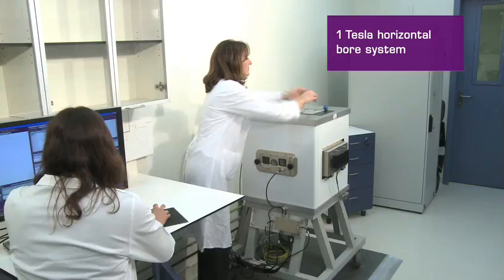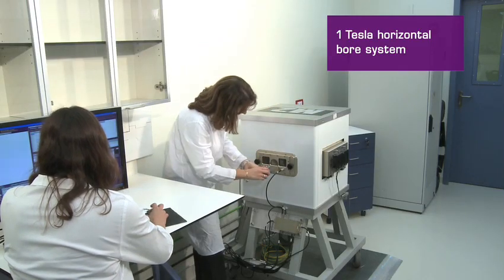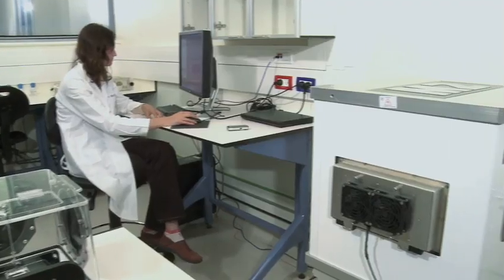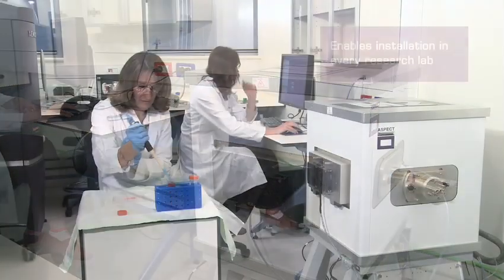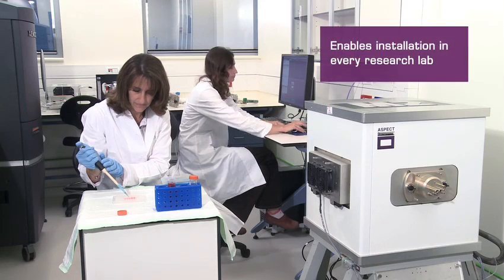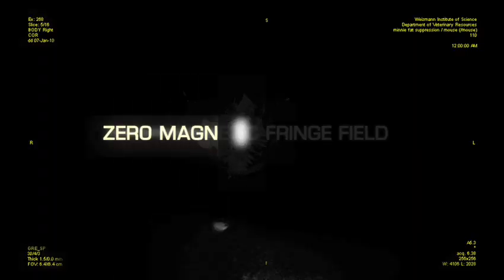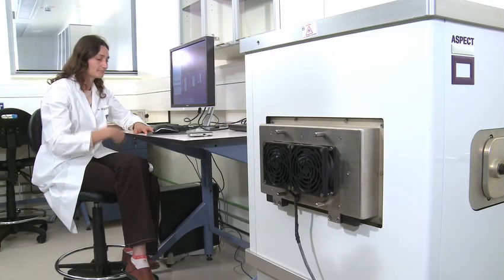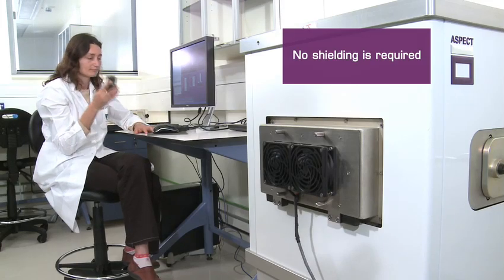The one Tesla horizontal bore system, with its unique compact dimensions and footprint of just two square meters, enables installation of this revolutionary MRI system in every research lab or point of care. Aspect's compact MRI system has zero magnetic fringe field, so no shielding is required.